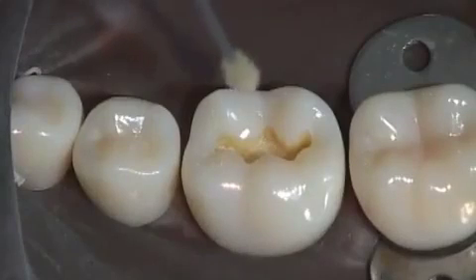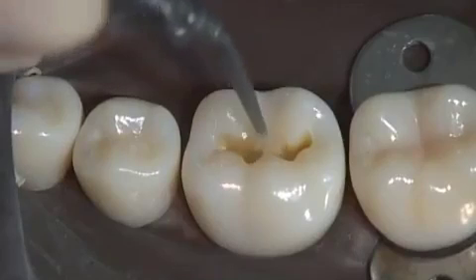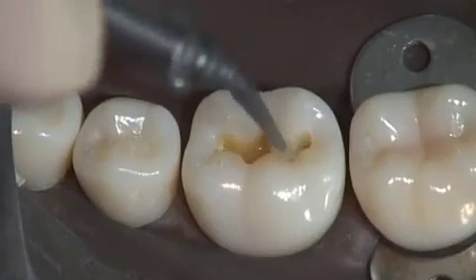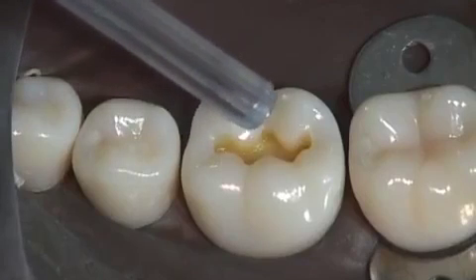Apply Gluma desensitizer with a microbrush and rub it into the dentin for about 30 seconds. Then dry with a light air spray to evaporate the solvent.